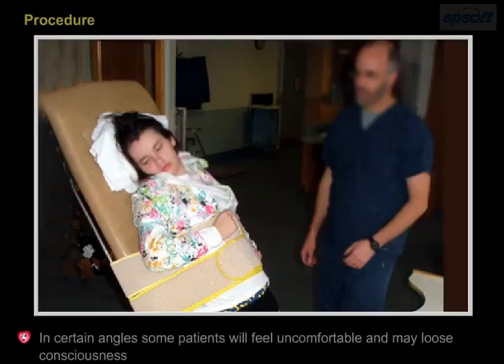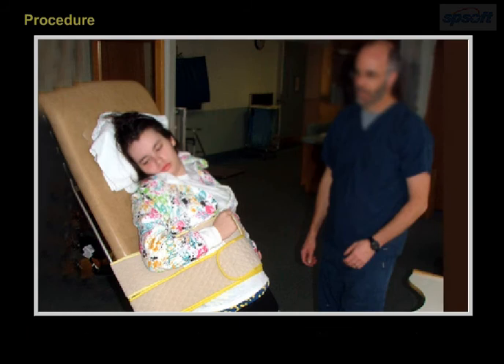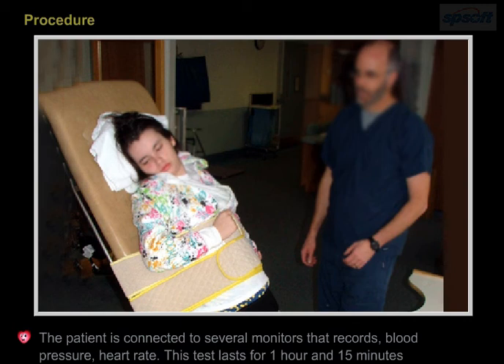In certain angles, some patients will feel uncomfortable and may lose consciousness. The patient is connected to several monitors that record blood pressure and heart rate. This test lasts for 1 hour and 15 minutes.